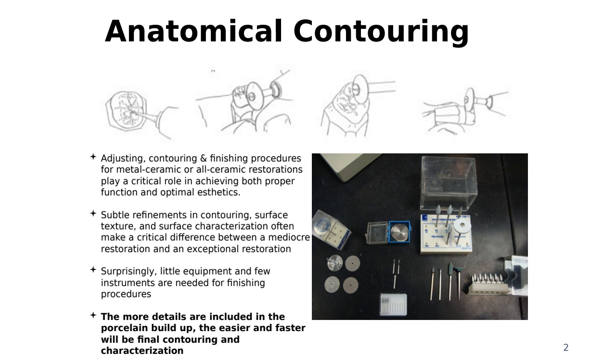Next question. So you can only use diamond burrs for zirconia, but you can use both stones and diamond burrs for porcelain, because I always heard that any other burrs besides diamond will just paint or contaminate the porcelain. Yes, that's true. And like I said, especially when we talk about metal, always have separate kits for different materials.